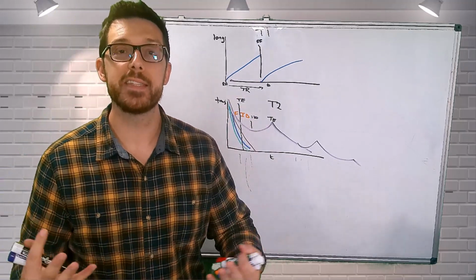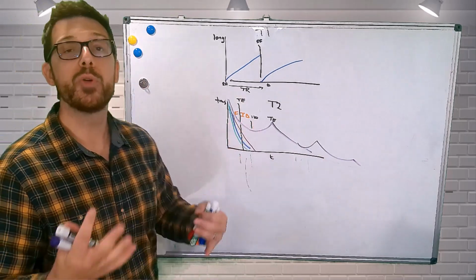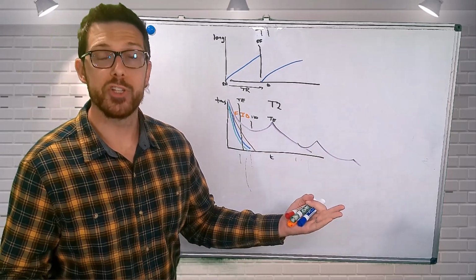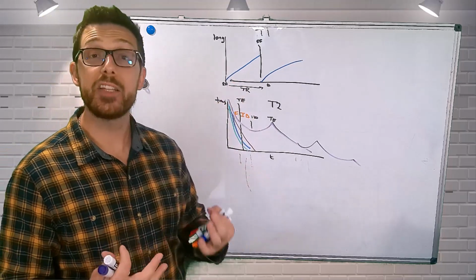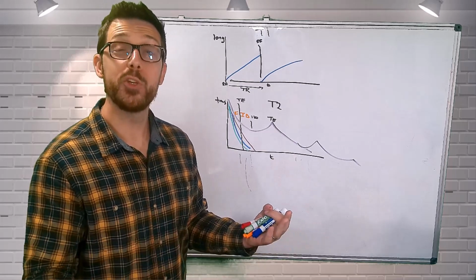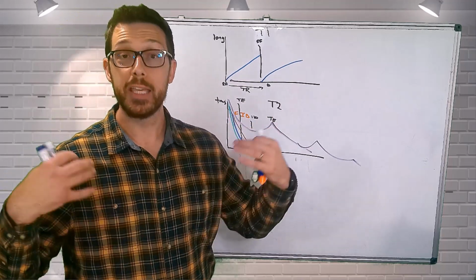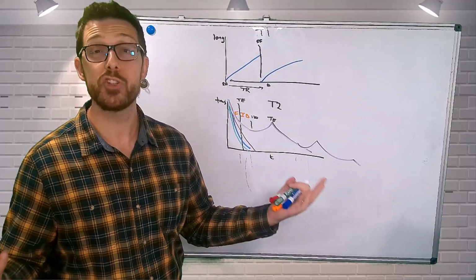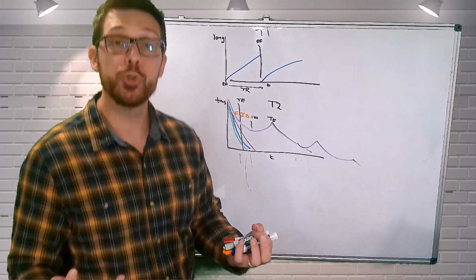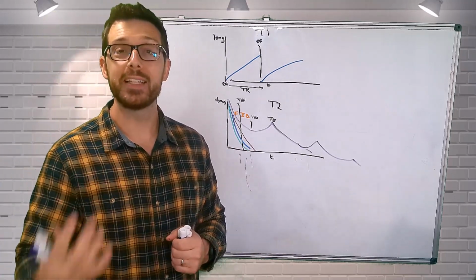And the difference that we see in these is that when we run a gradient echo, we don't utilize this 180-degree refocusing pulse. What we're utilizing instead is just our 90-degree excitation pulse or less, and sampling free induction decay, with these inaccuracies. And that leads to T2 star contrast when we image using gradient echo. But when we use spin echo sequences, we're utilizing a 180-degree refocusing pulse, which allows us to get true T2 contrast in our image. And that's essentially the difference between the two. When we use 180-degree refocusing pulses, we're going to get true T2 contrast. When we don't, we're going to get these inaccuracies represented in our image, and that leads to T2 star contrast.